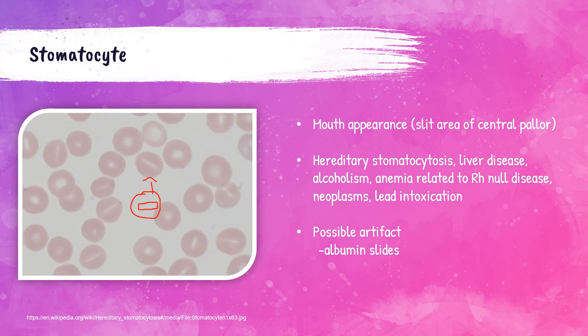Stomatocytes can also appear on the peripheral smear as artifact — they're frequent in slides made with albumin. In hematology, you may prepare a peripheral blood smear with albumin in cases where there are smudge cells, which are white blood cells damaged in the process of making the smear. Adding albumin can prevent this breakage. However, with albumin smears you cannot evaluate red blood cell morphology as they can create false stomatocytes. In that situation, you would count white blood cells on the albumin smear but look at red blood cell morphology on the original peripheral smear.